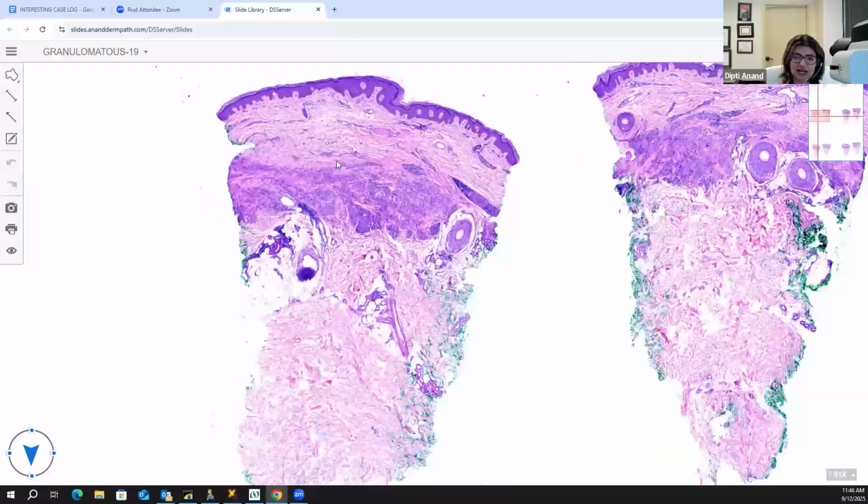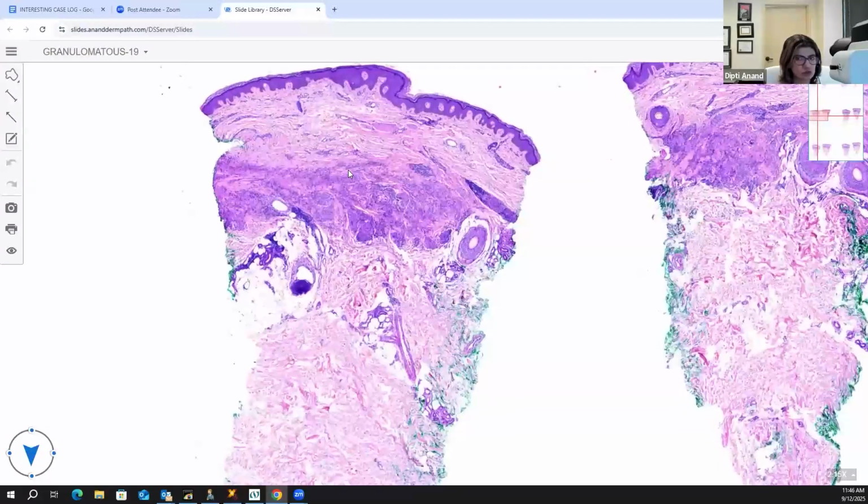And so I was sort of favoring sarcoid. Yes. So, this is the kind where your probability of finding a foreign body is going to be very low because you see the kind of punch this would have been done for a sarcoidal lesion. Most often when you get the sarcoidal granulomatous form of foreign body, you're not thinking sarcoidosis. It actually presents like a bulky lesion where you are thinking a cyst or something different. So it ends up in an excisional biopsy. So most often those are bigger biopsies. Okay, this looks like it would be a tiny punch into a nodule.